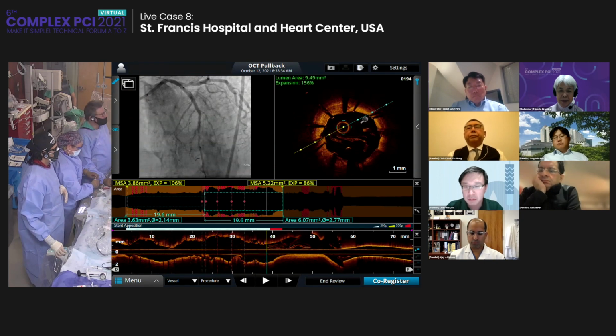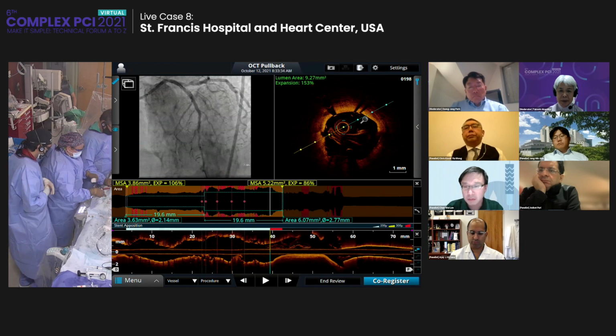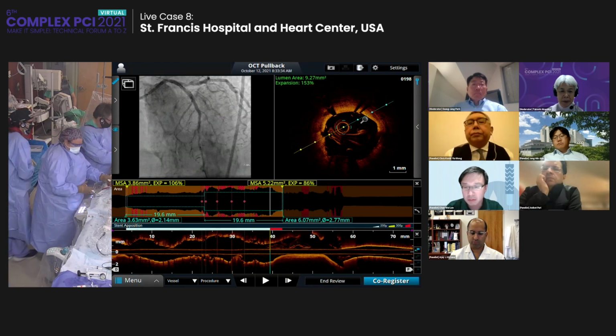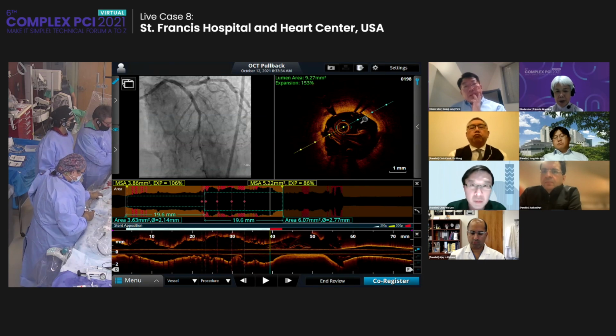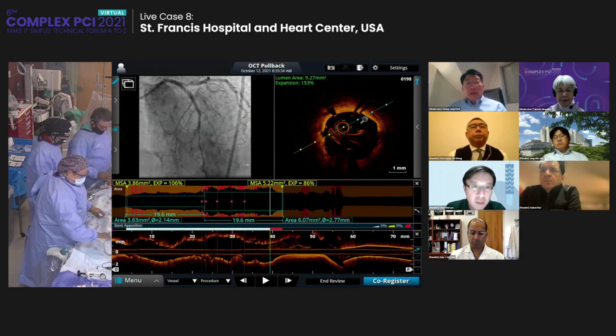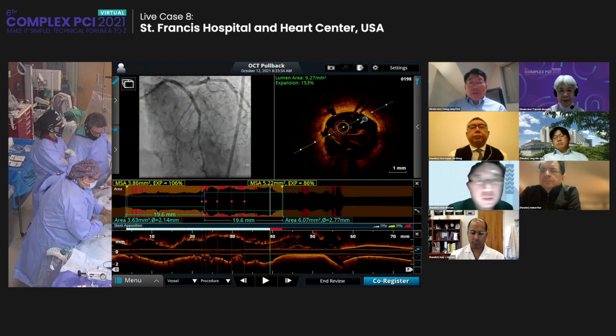The stent looks good, the angiogram looks good, and there's no edge complication. So we are done, unless there's anything else you guys want us to do. Congratulations, a good result. Ali, it's really good cases.